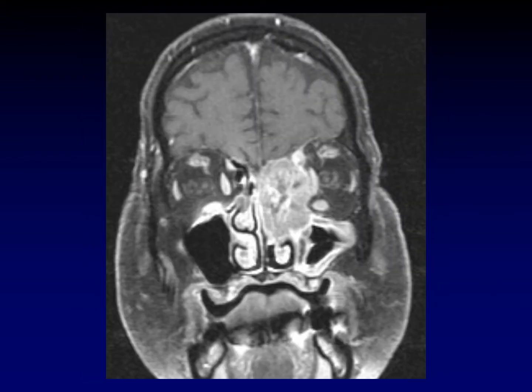This is an example of an actual neoplasm secondarily involving the orbit. You can see this heterogeneously enhancing mass is pushing on the orbital contents. It's not really invading the way that the fungal case was showing invasion — it's just pushing things out of the way. This is metastatic disease, I believe from a lung primary.